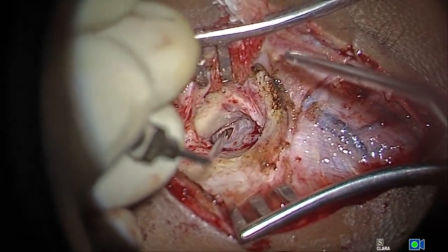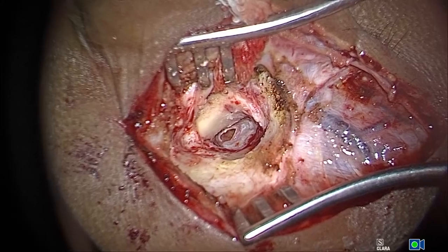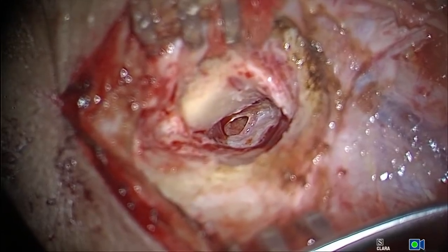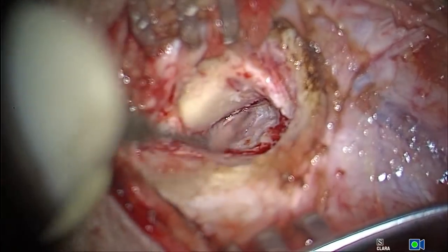So that's an anterior perforation, you can see that very clearly. Can you all appreciate the perforation there? So I'm just going for a slightly higher power. See how beautiful the perforation is seen.